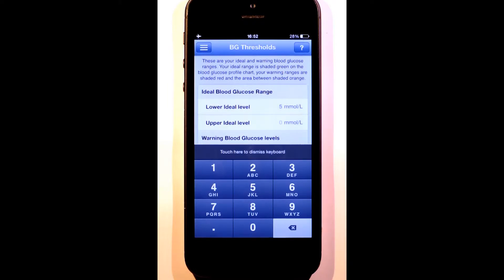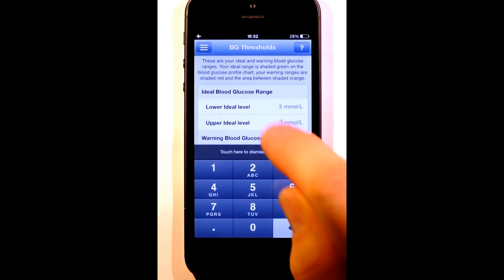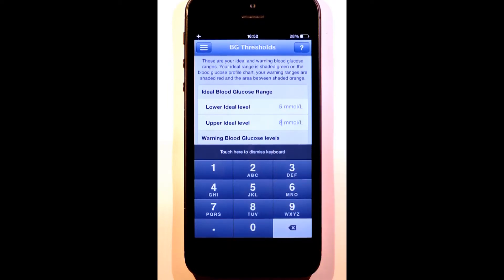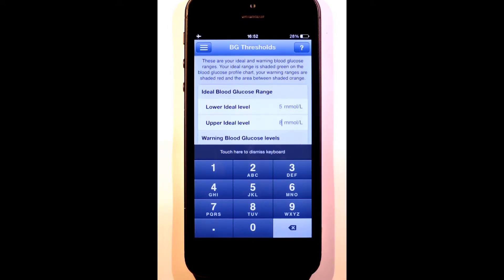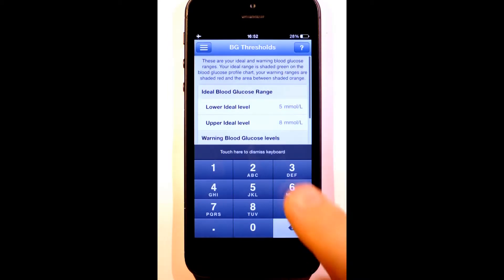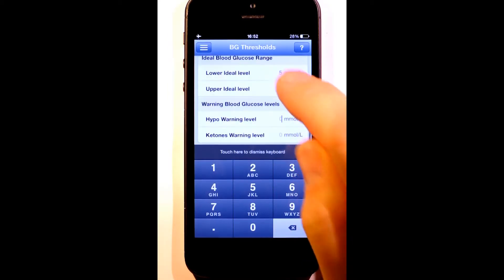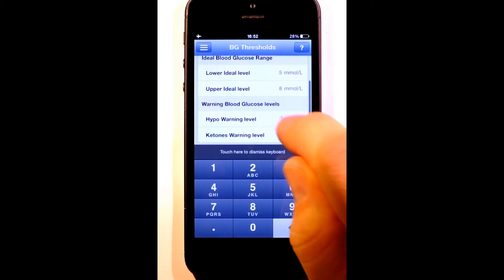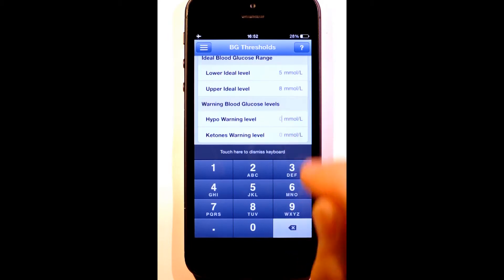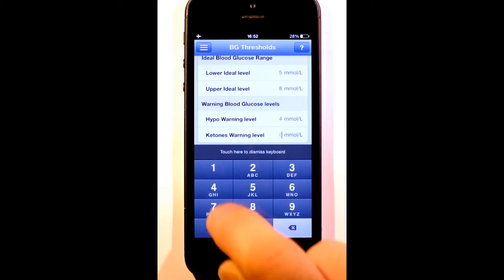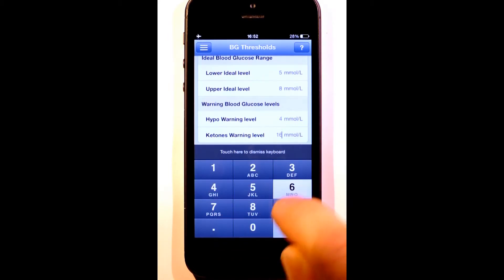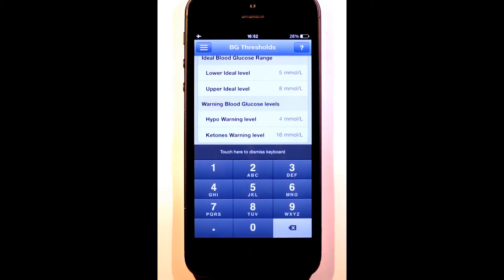For my upper limit, I'll set 8 mmol per liter because the normal range for a non-diabetic doesn't go above this value. I've deliberately made this range quite tight to give myself something to aim for. I'm setting the hypo and ketone warning levels which determine my red bands. The values between the ideal and the warning bands will be colored amber.